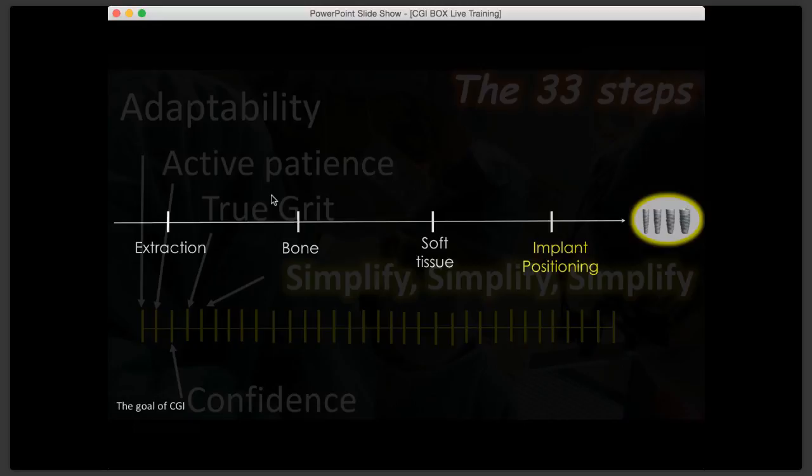So timing is everything in life, but also in implant surgery. What is timing? Timing is the rotation of the platform around its axis. Depending on what timing you have, there are six or three positions, sometimes seven positions. It all depends. Important.